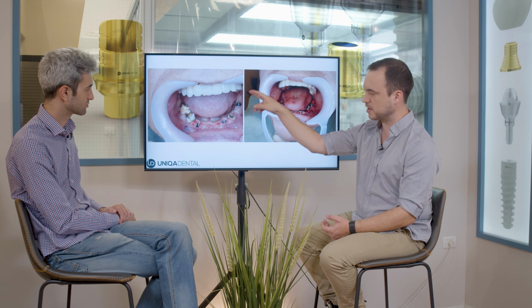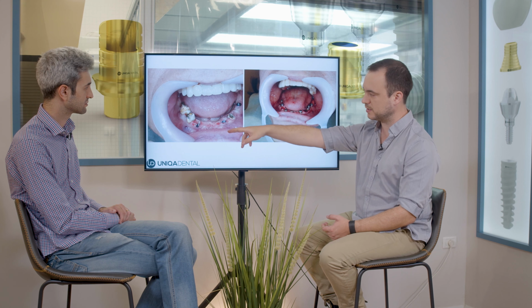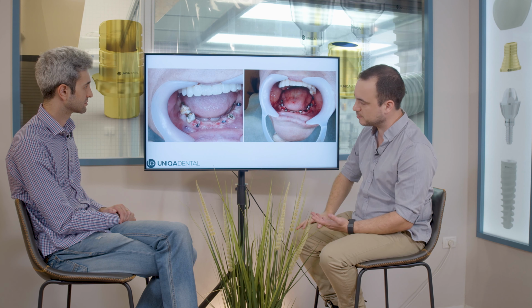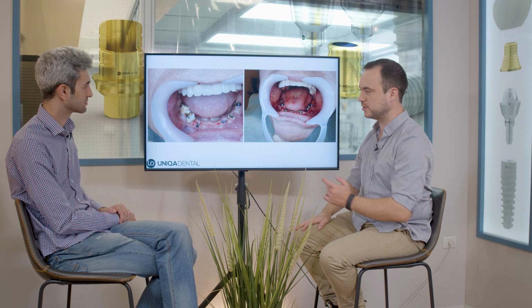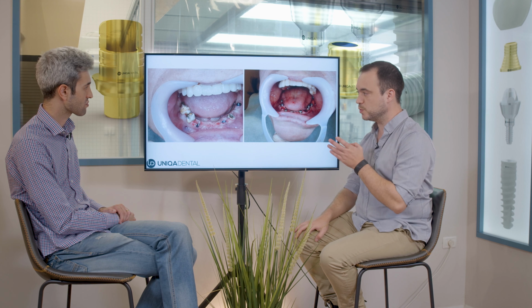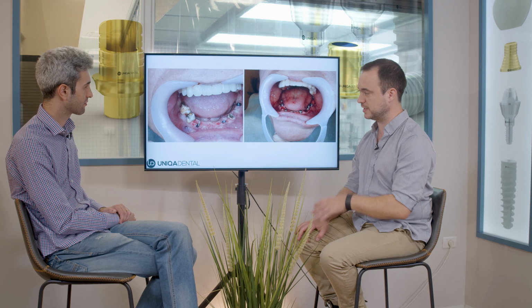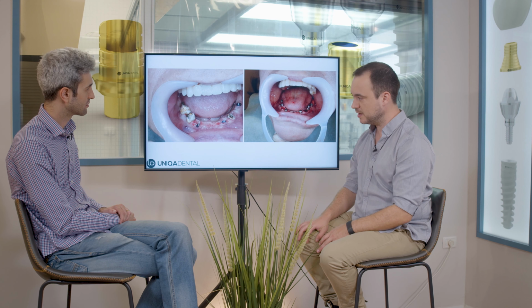You can see that we have an implant around the second molar. We can have an implant around both canines, around the second premolar and second molar also. And we returned the bridge, the PFM bridge that she had. We gave those implants some time to also integrate.